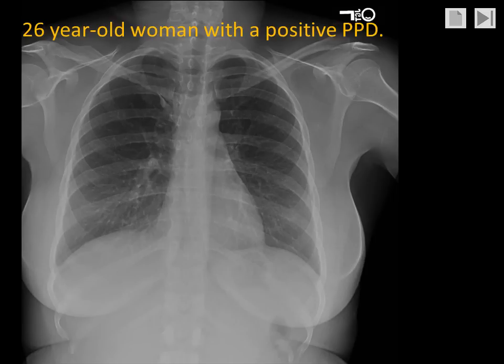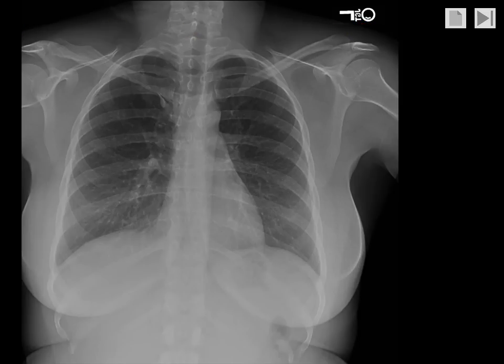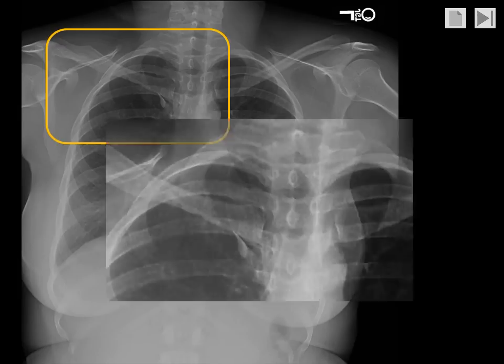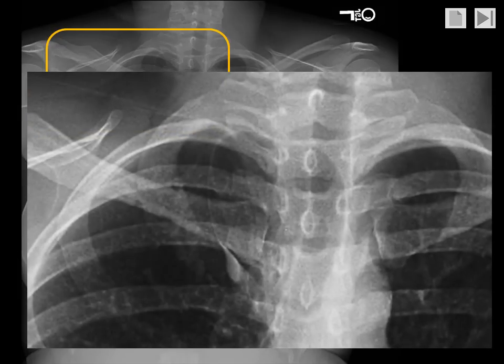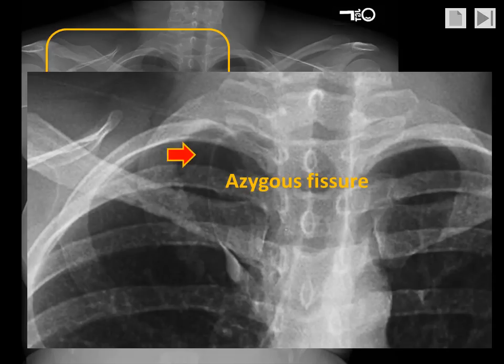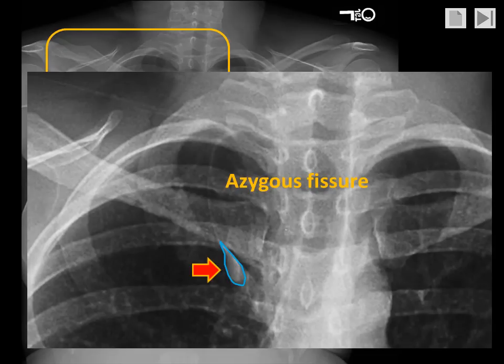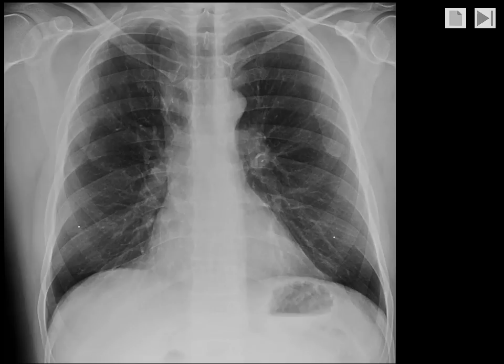In a typical case, we see here an asymptomatic 26-year-old woman who is having a chest radiograph because of a positive PPD. We see a rounded opacity in the right upper lung fields. If we magnify this section of the chest, we can see a very thin white line representing the four layers of pleura lining the azygous fissure. And at the bottom of this line, we see an almond-shaped opacity that represents the azygous vein passing through and surrounded by the lung parenchyma.